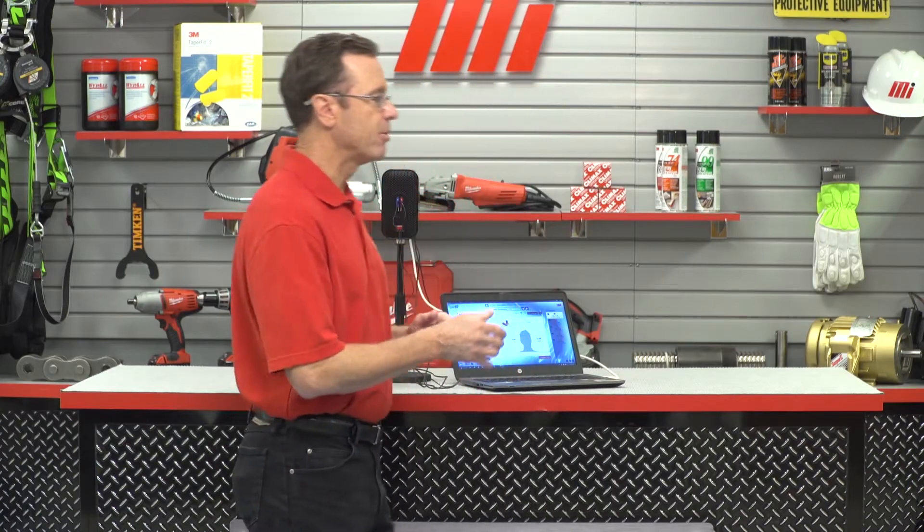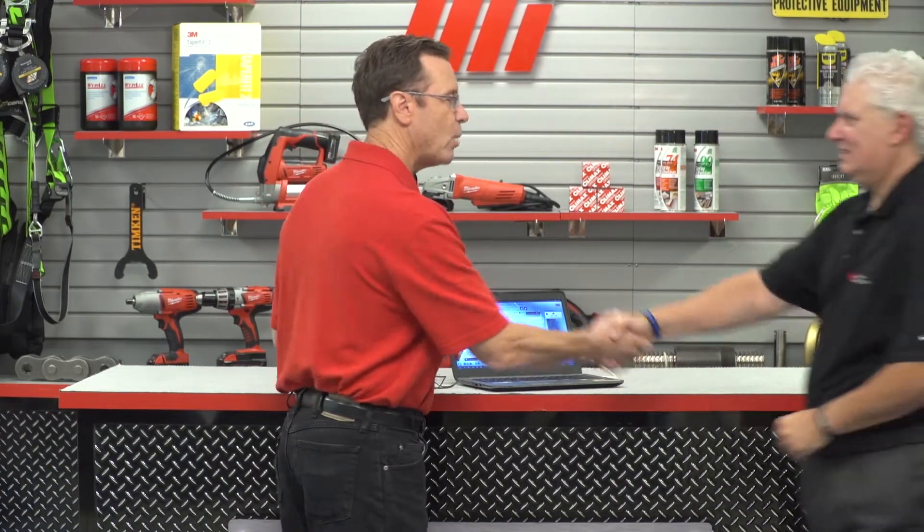Hello and welcome to another MI How To video. My name is Tom Clark, I am your host and on today's How To we're going to show you a simple test that could help you save your hearing. So pay close attention. And helping us out from 3M is Mr. Steve Jacksek. Steve, welcome.